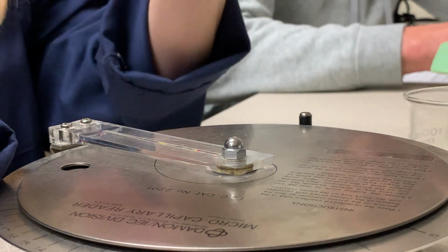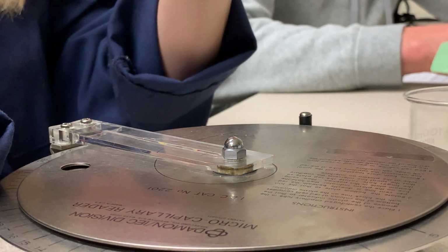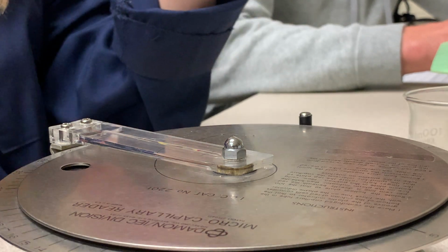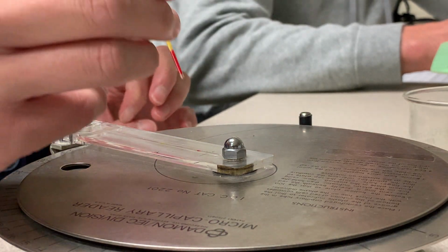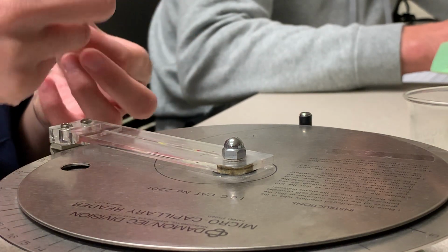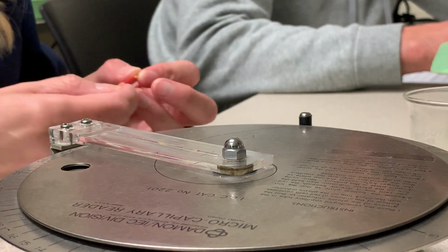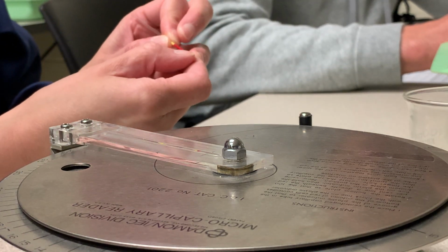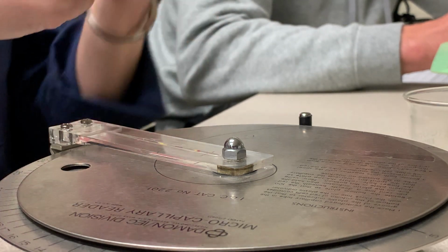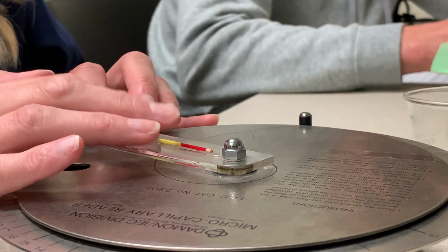So this is how the tube would be. This isn't real blood. I'm not allowed to use real blood in here because we don't do aseptic technique. I used to use real blood, and then they found out and they said no. So this would be like a tube of blood. They put it in a centrifuge and spin it out and put clay at the bottom, what this white is, so that the sample doesn't come out. And then what you're gonna do is take this.